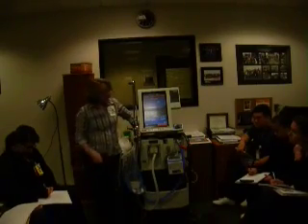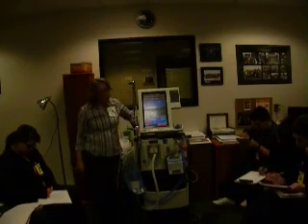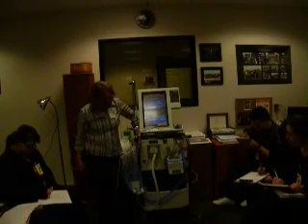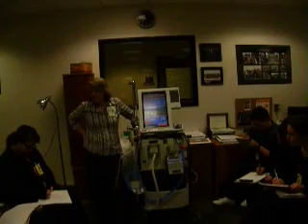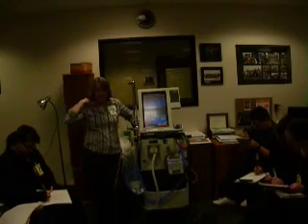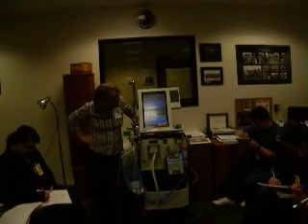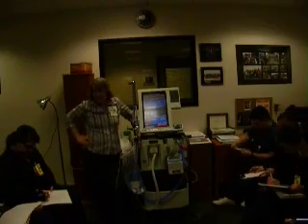Yep. And then the next one here, it says mode. So you'll see we have assist control, SIMV, spontaneous, and bi-level. Bi-level, way at the end of the term, don't worry about it. That's one of those specialized modes of ventilation I was telling you about. The ones that we'll mainly be using are assist control and SIMV.